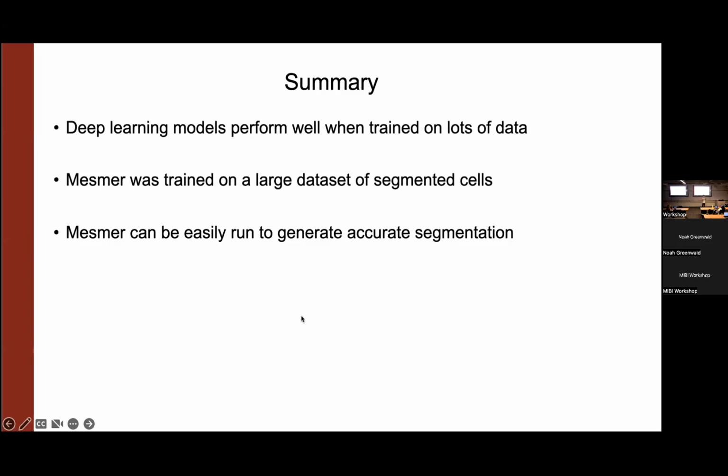If that cell is touching a tumor cell, and a lot of the markers we care about are on the membrane, you're going to get bleed over either from segmentation inaccuracies or just because it's actual tissue data, they're physically next to each other. So what do you do when your tumor cell looks like it expresses CD45 because there's an immune cell right next to it? Candace is going to talk all about the work we've been doing on that in the next talk. The short answer is it's a problem, and it definitely interferes with downstream analysis.